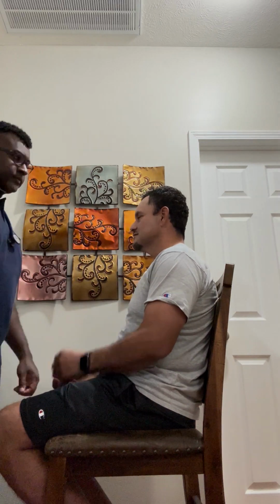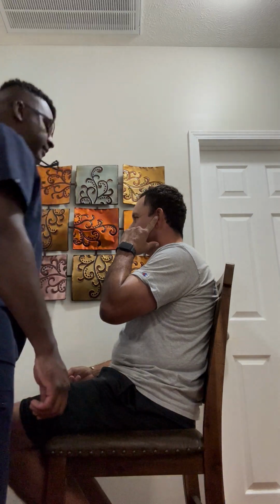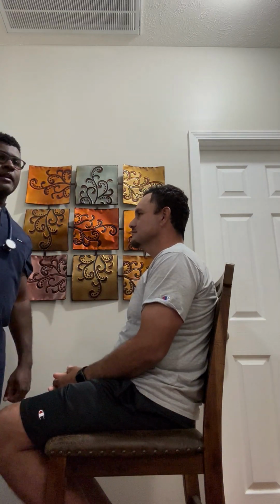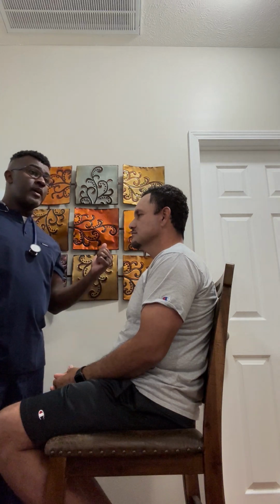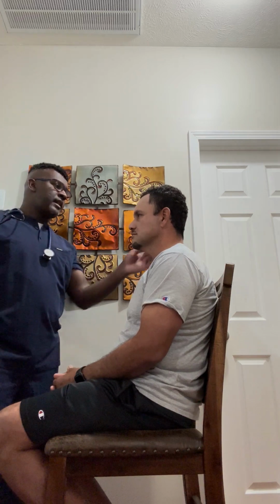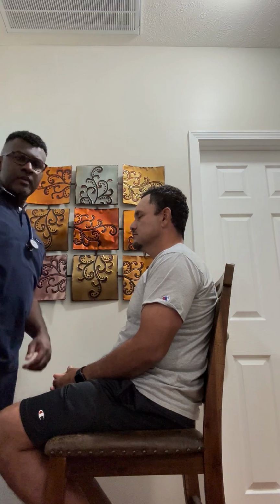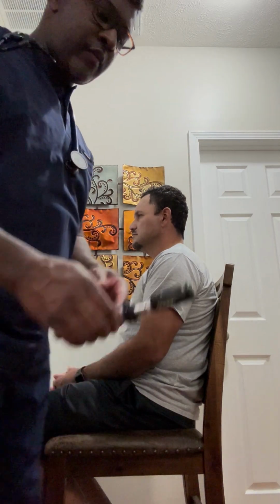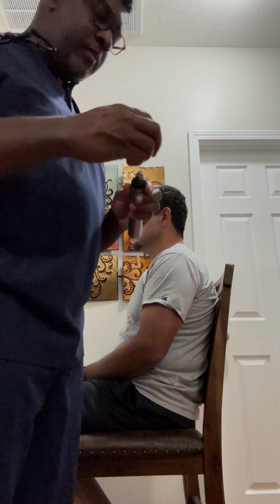Same thing with this ear. Okay, all right, did that. And I'm going to do the tug test before I insert my otoscope. I'm going to pull down on the pinna. Let me know if there's any pain or tenderness that you feel. No. Okay, tested both. So I'm going to switch over to my otoscope.